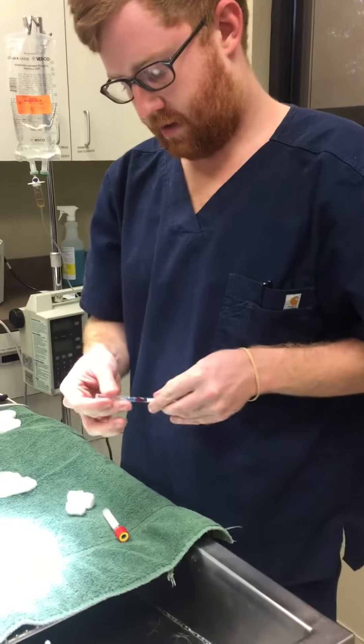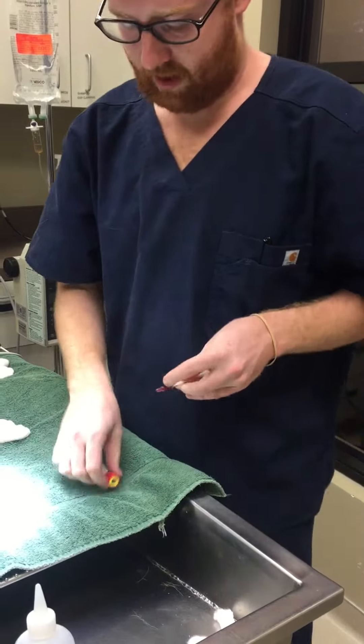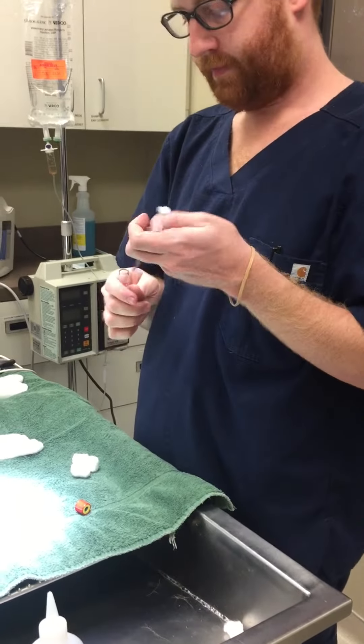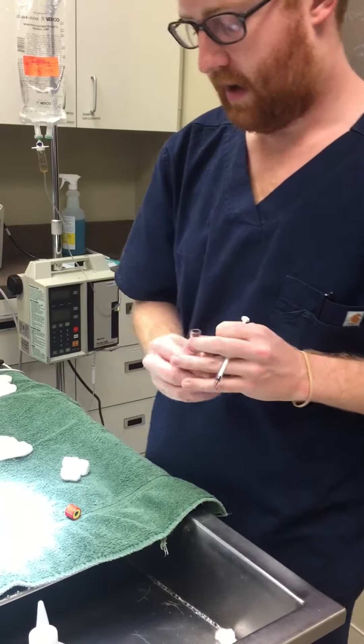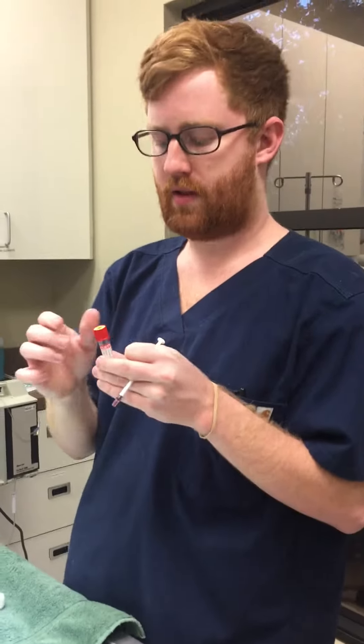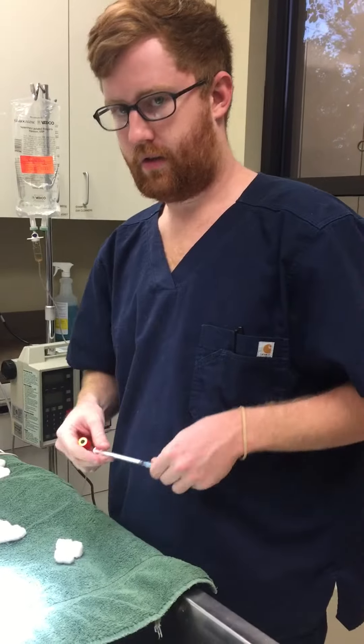I'm going to go ahead and cap my needle and take the needle off, and we're going to put it in the appropriately labeled blood tube, and we'll just cap that. We'll be able to perform any testing if necessary, and that is how you do a feline jugular venipuncture blood draw.